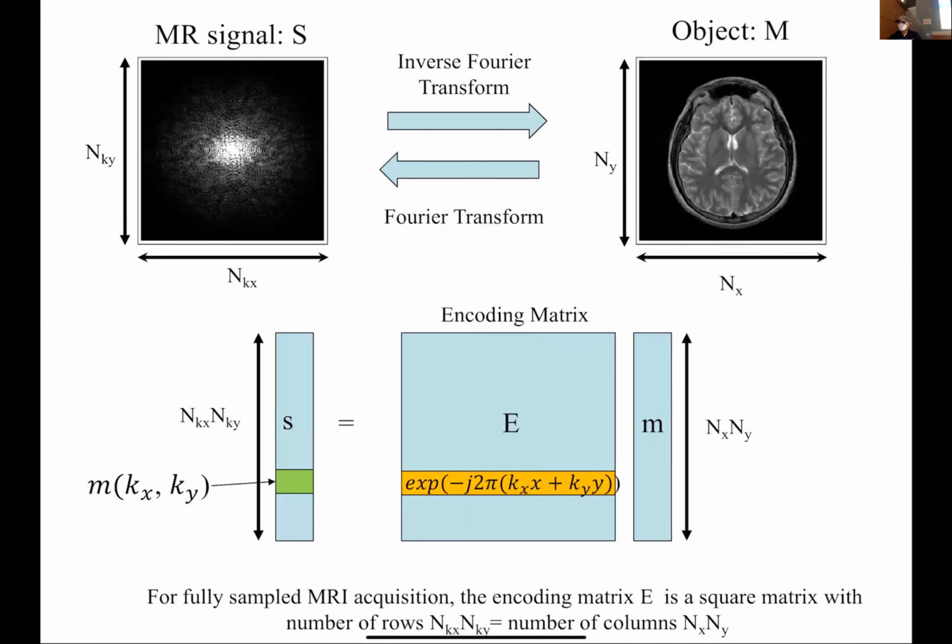In your homework, you'll play around with some code to do this, which you'll just follow along. But here's the idea. This is the picture we've looked at so far. To get any point in K-space, remember, I just multiply this object by some phasor pattern and then put the value at that point in K-space. And then to get another point in K-space, I multiply by another phasor pattern and put that in K-space. But now let's think about another way of looking at this.